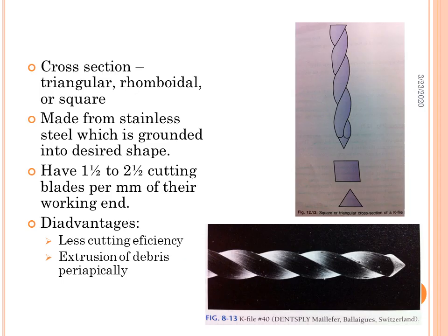So what happens is, just before separation, you will see that there is going to be a kink or a sharp bend, or these would have unwound, so it would have become relatively straight. That is the time you have.